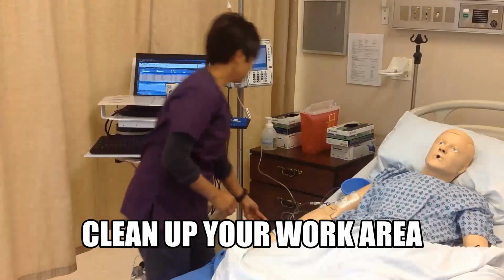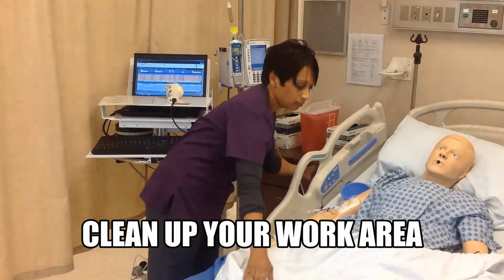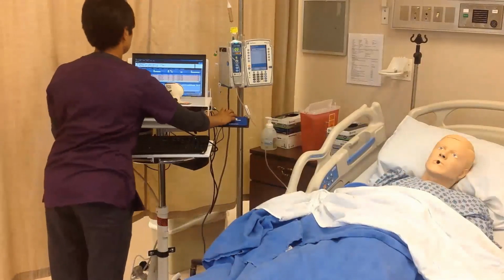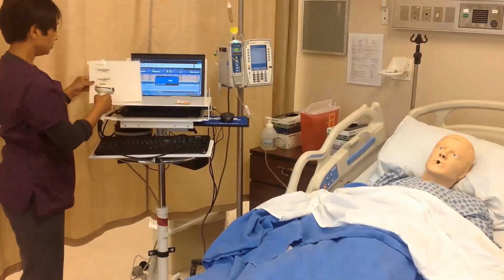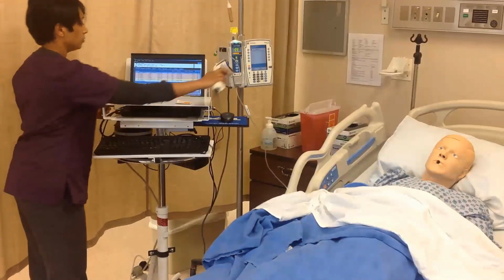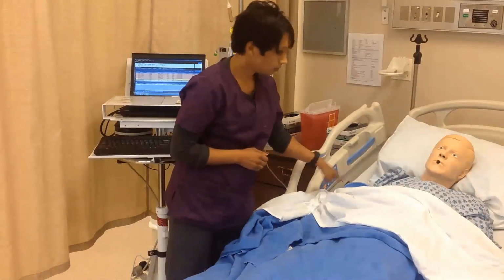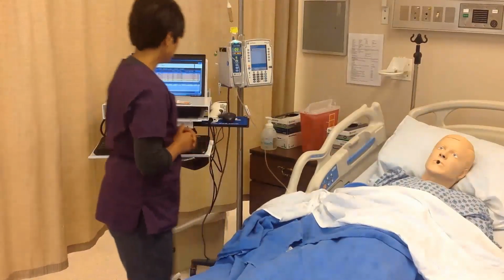Put the side rails up and lower the bed. Assist your patient into a comfortable position. Chart medication by left-clicking on chart at the bottom of the screen. Now scan the nurse training badge. This is your electronic signature. Let the patient know you are done. Make sure patient has access to the call bell system. Wash your hands and exit the room.